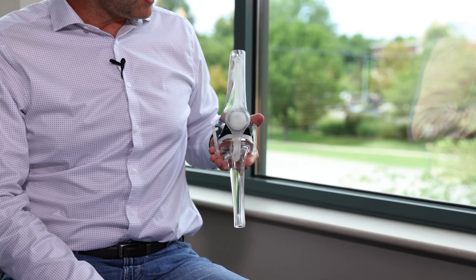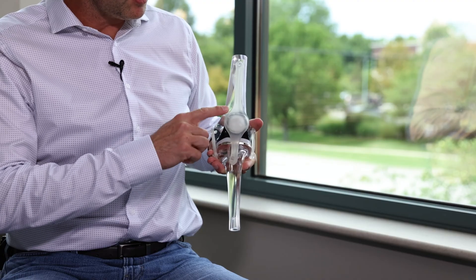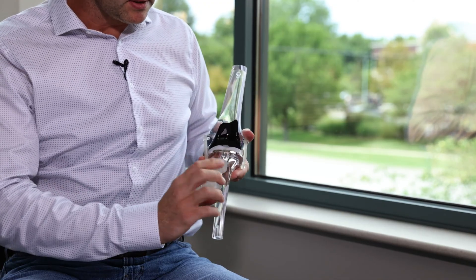So a knee replacement really is just metal and plastic. In this model, the clear parts are the bone — this is the thigh bone or the femur, this is the shin bone or the tibia, and this is the kneecap in the front. I'm going to move it out of the way so that we can see inside.